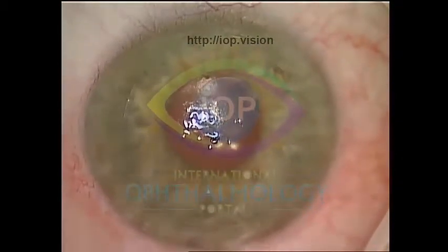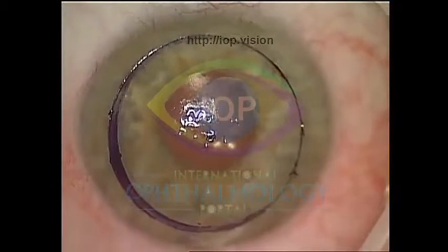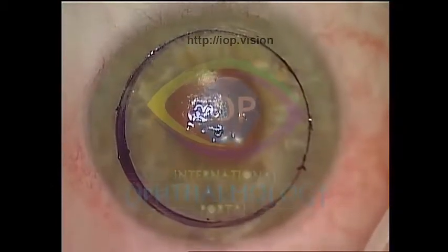Yeah, sure. Those are great points. I think the one thing you don't want to have to do through the paracentesis incisions is manipulate the graft and have a hard time getting under it.